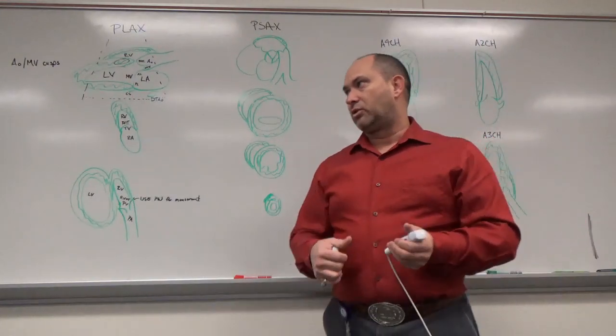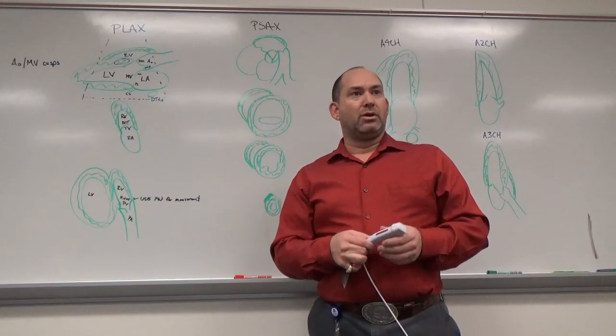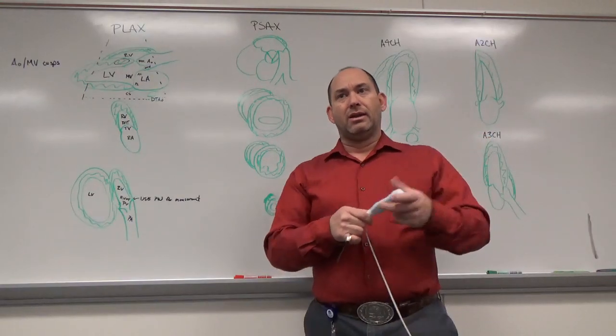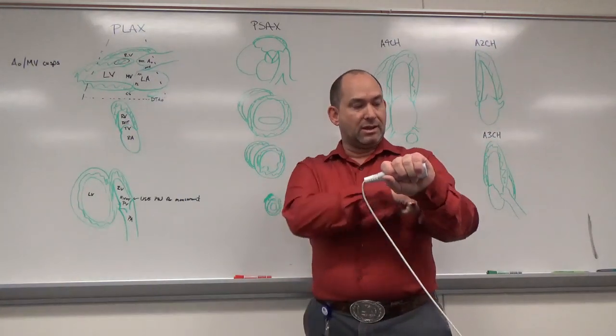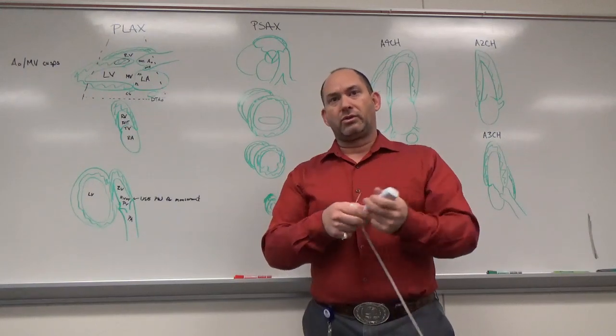And then Tammy and I were both talking yesterday, in some labs, people might get mad at you for doing this, but when I'm scanning, I personally hold underhand for parasternals because for me it's more comfortable. When I hold it the other way, it binds up all my muscles and it gets tense. So for me, it doesn't work. So this is a better method.